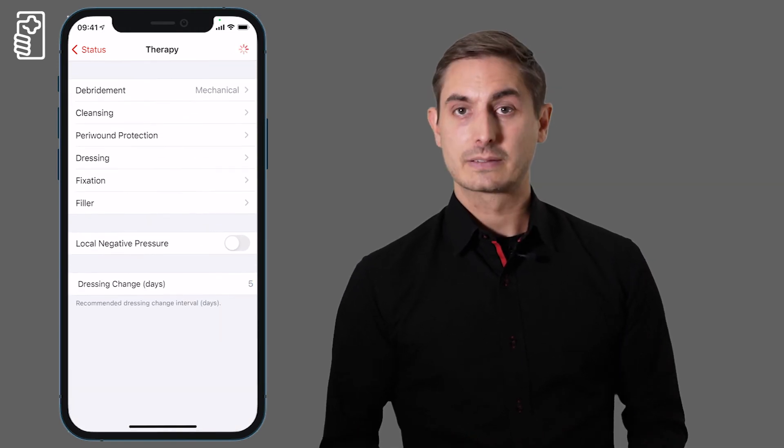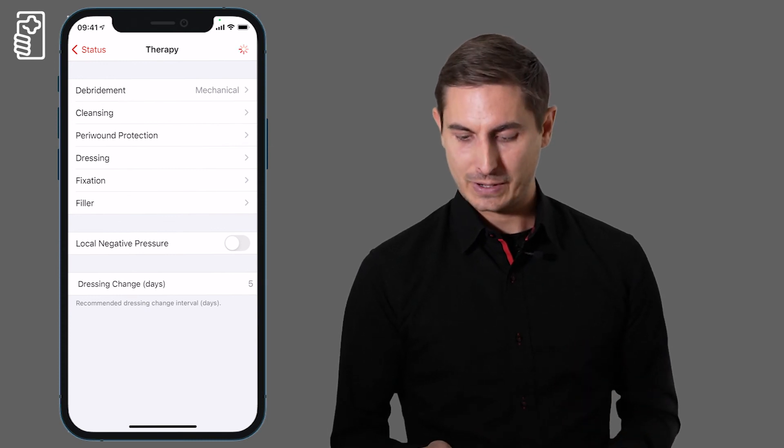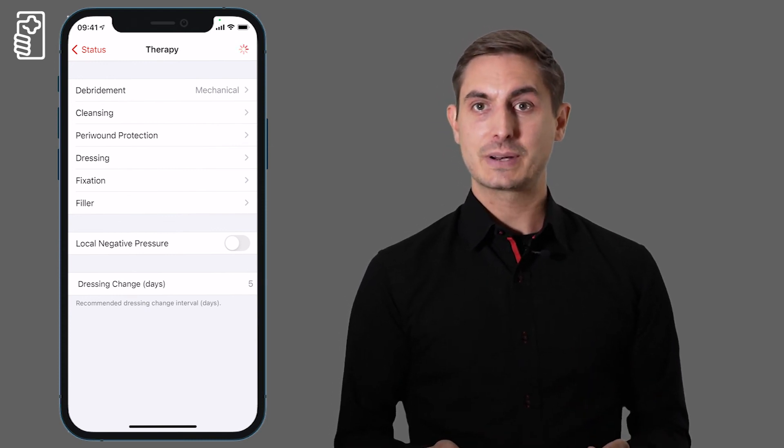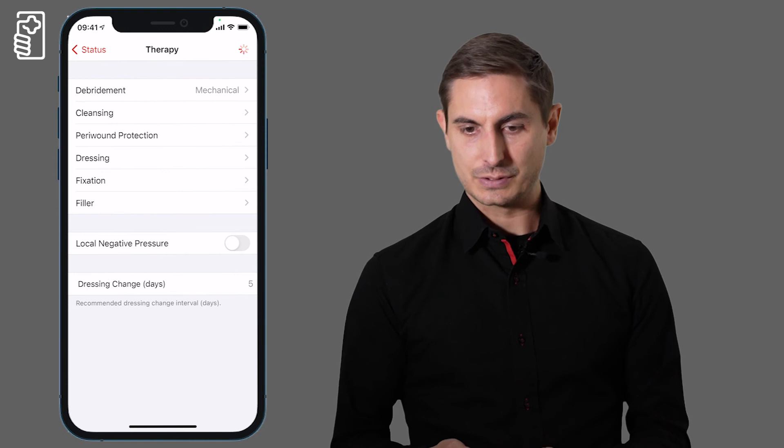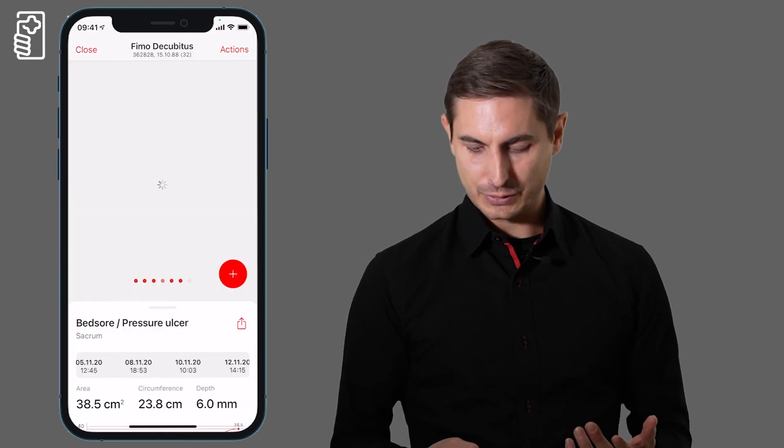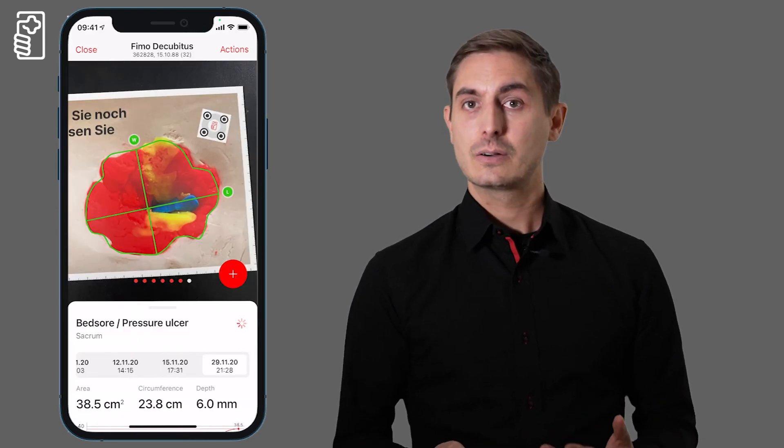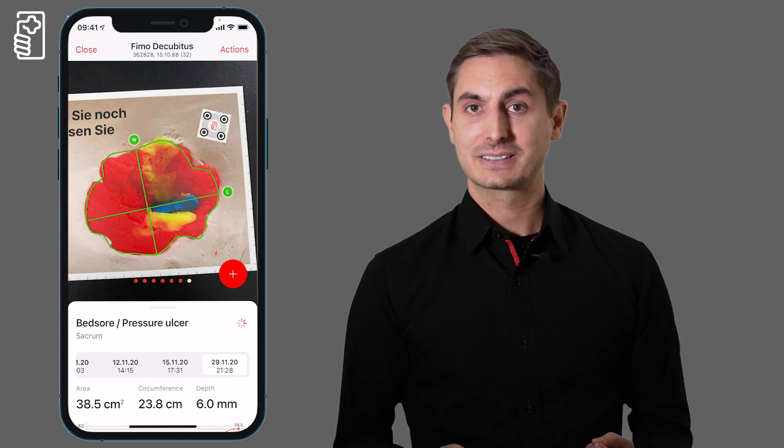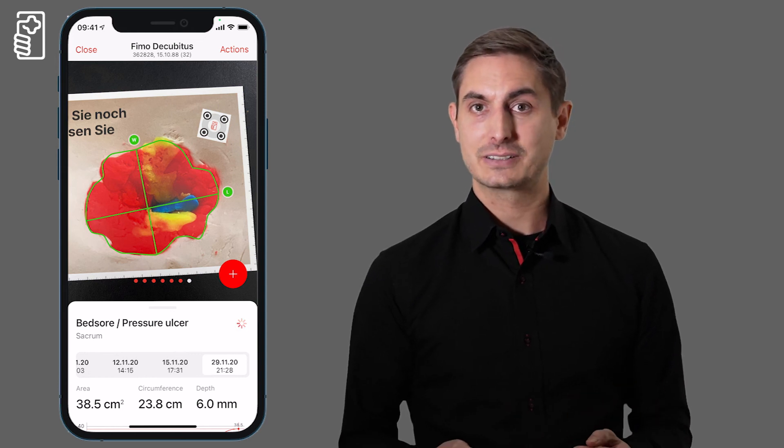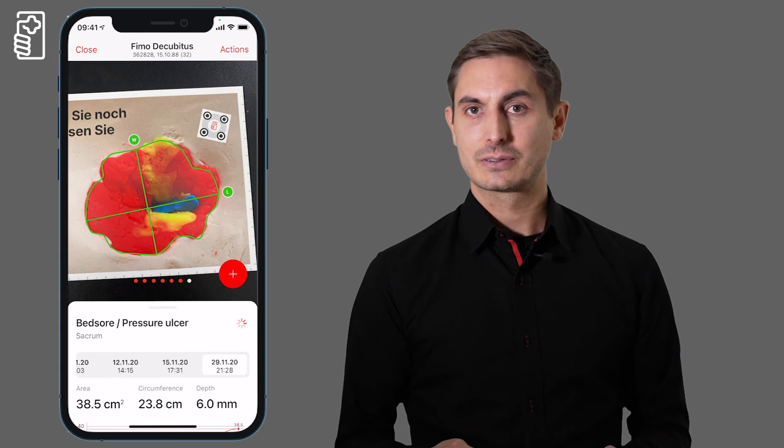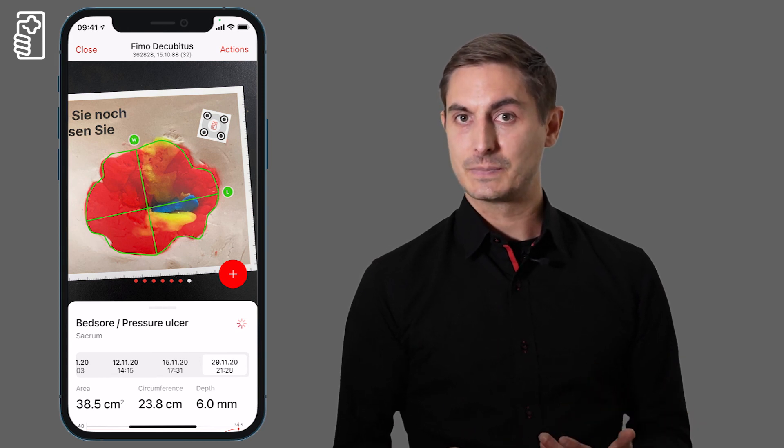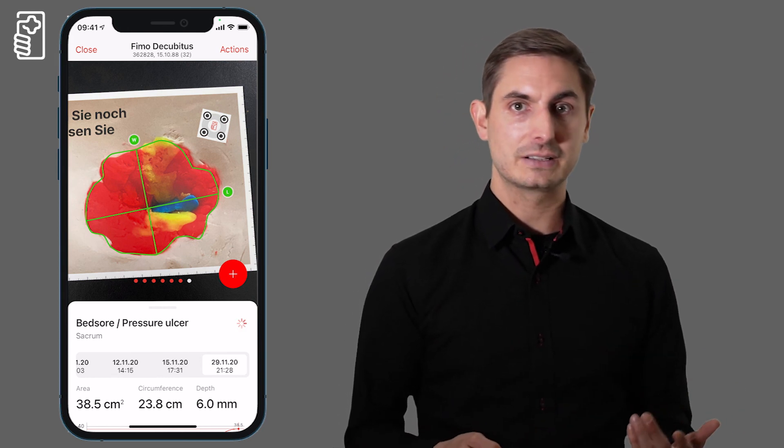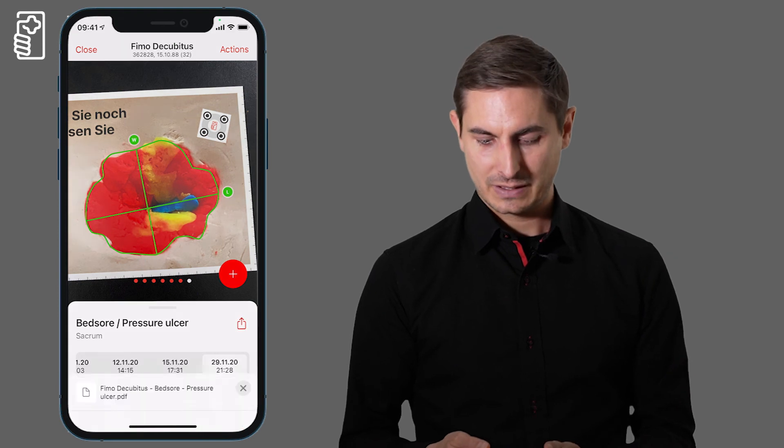And now when we are back on the timeline we can also create a report with the standard sharing functionality of iOS and Android. We can send it via email or store it locally.